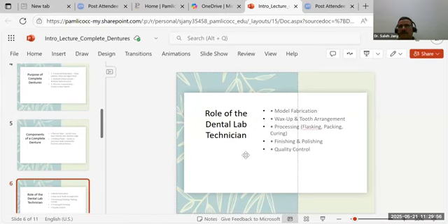There's electronic measuring to see the bite, whereby we can find the maximum bite, which is the one where we have the vertical dimension of occlusion, but this is more expensive and used more in labs or colleges. So the dentist will find the vertical dimension and horizontal relation. He will find the midline.